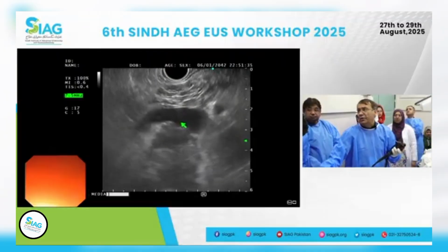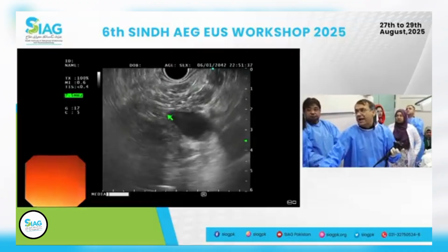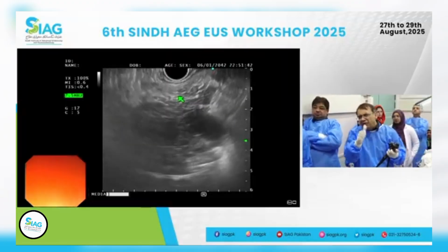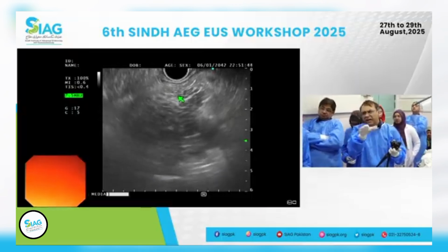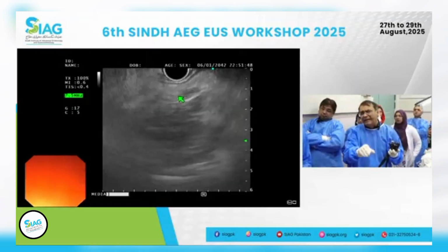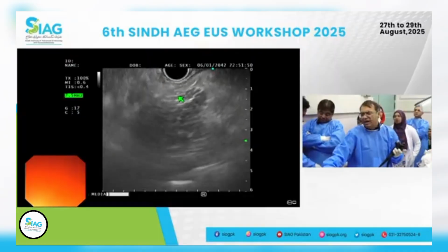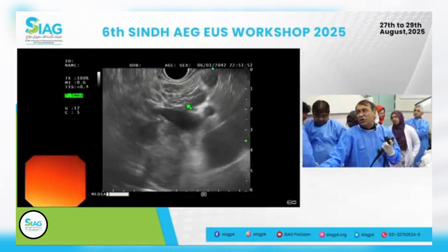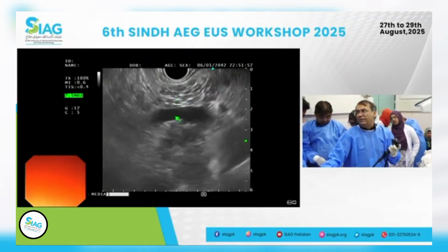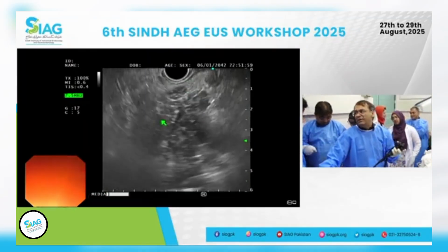So anyway, going back to this pancreas, the melanoma, lymphoma, I don't think they cause enough obstruction. They're not like an adenocarcinoma, with enough obstruction of the pancreatic duct for it to get dilated and have major parenchymal changes. The pancreas right here was a little bit atrophic in the body tissue, but here it's a nice pancreas, especially in the neck area.